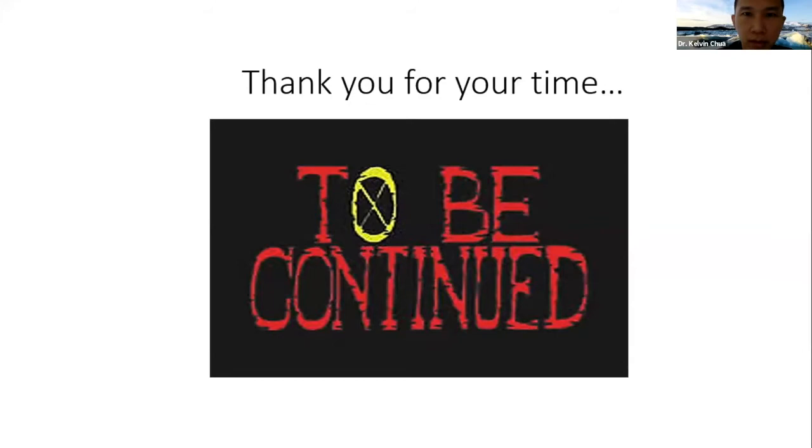And I think there's also a mention about when you have a return beat, you're not sure whether it is an AV nodal echo or a junctional beat. A lot of times when we're doing an EP study, we also want every observation to be repeatable. So you always repeat the stimulation to double check whether this is a consistent finding. If it's a consistent finding, then you're more inclined to believe one or the other. And you also touched on a very important last point, from your last few slides: when there's a tachycardia without a 1:1 relationship, an AVRT using an accessory pathway is likely to be eliminated. So thank you.